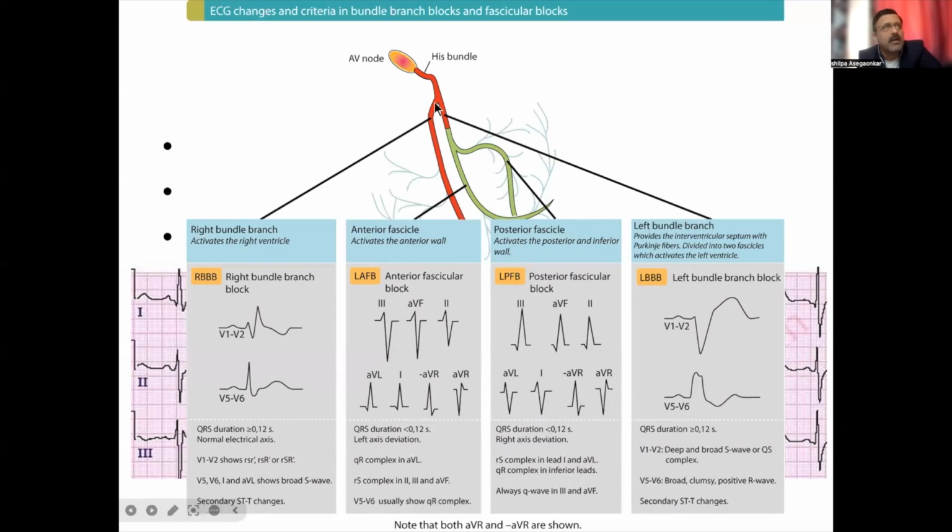It means the right bundle branch block is already there, plus the anterior fascicle is also blocked. These are dangerous patients, in the sense that these cannot be done at nursing home level. You can do this at institution level where pacing facilities are available. If suddenly this patient lands in complete heart block, what can you do? You cannot do anything if you are doing this case at nursing home level, or you should post these patients where such facilities are available. Such is the importance of pre-op evaluation and picking things properly on an ECG.